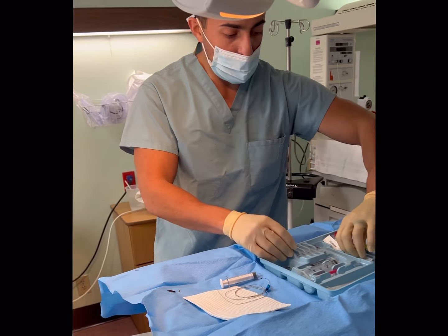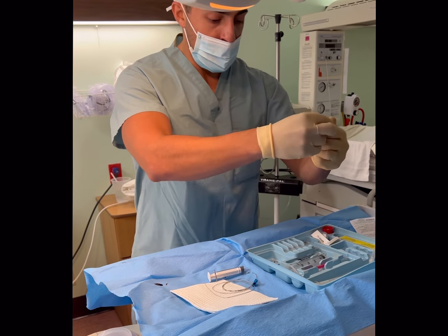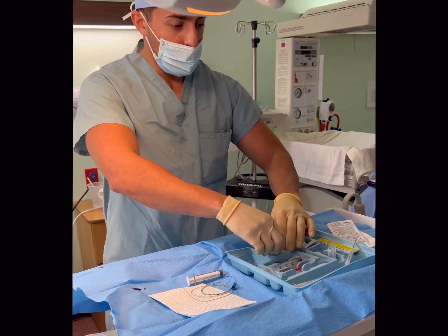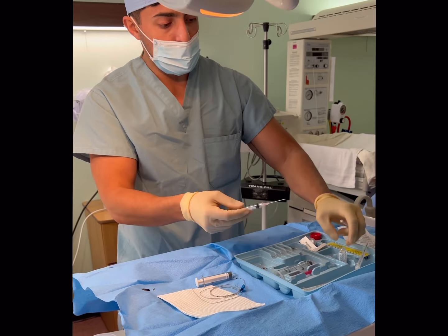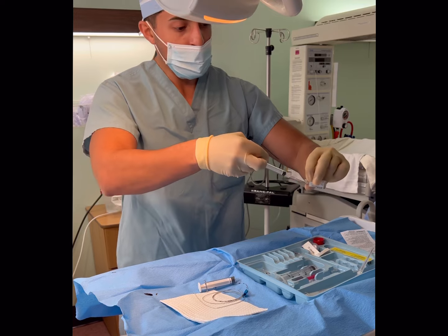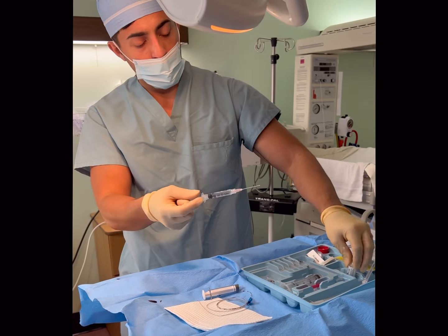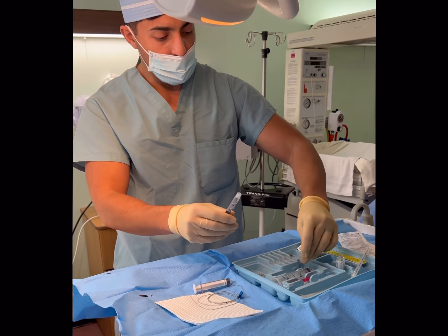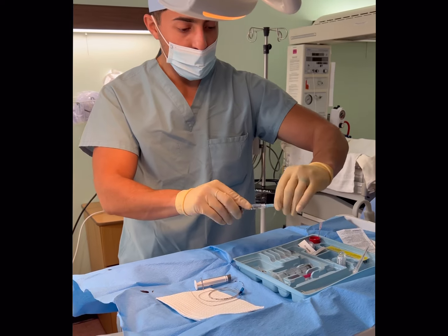I'm going to go ahead and numb her skin up. While that betadine is working on her skin, it gives it a chance to dry. I'm going to drop some 1% lidocaine just to anesthetize the skin. How are you feeling? She's very nervous, but we're doing great — still smiling. I'll use my 25 gauge here.